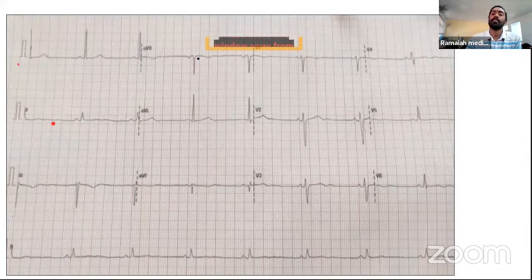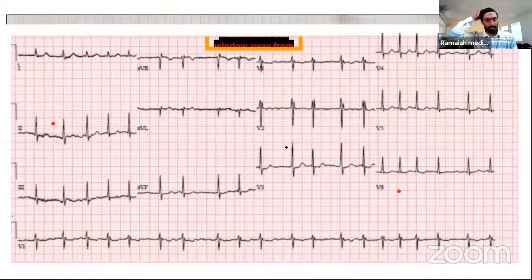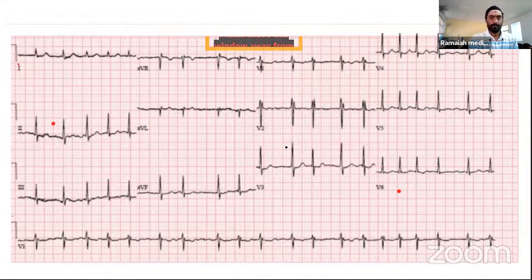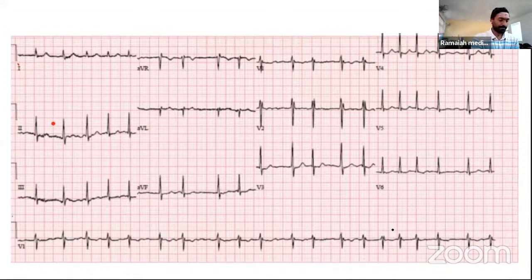Okay. Good. So can someone tell for this, can you calculate the heart rate? 100 to 150.